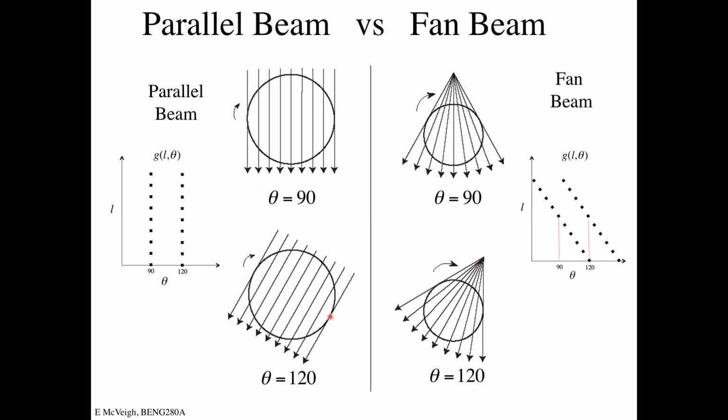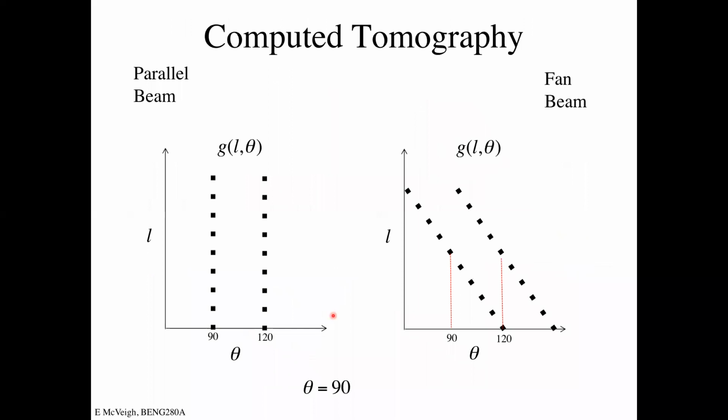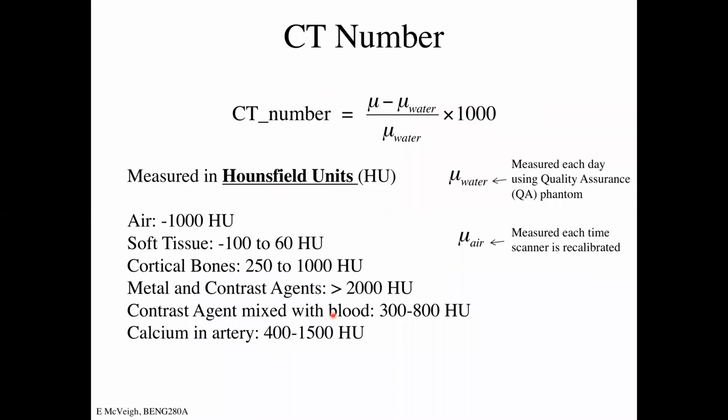It tells you that the parallel ray here was actually obtained at a different time than the parallel ray here, slightly later or earlier. But that difference in time across the sample is however much the gantry rotates over one detector length. So it's not that much. It's like 50 milliseconds or something.